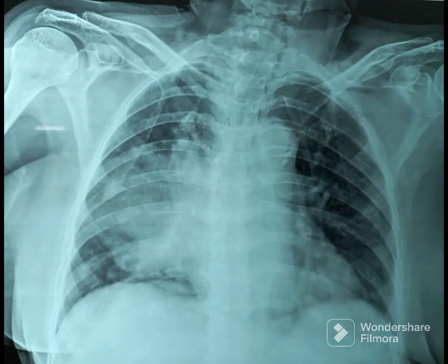Let's see an example. Look at the chest X-ray keenly. You may find the right heart border is obscured or indistinct — so we call it the right heart border is silhouetted. Now look at the right diaphragm — it is very clear.